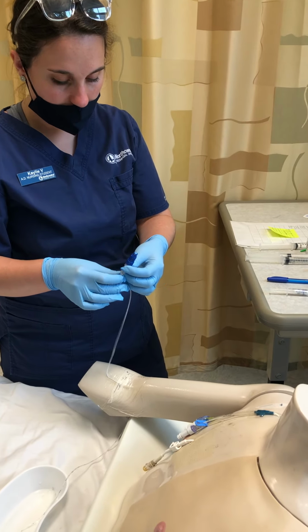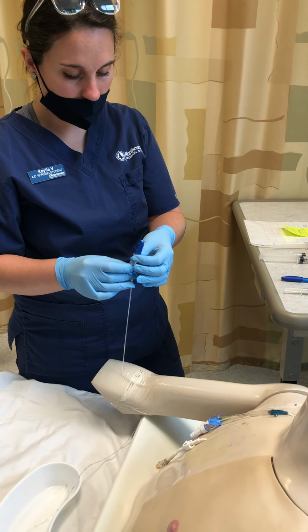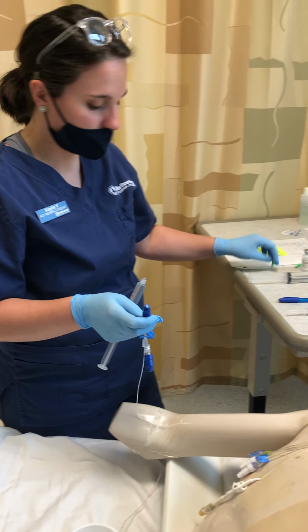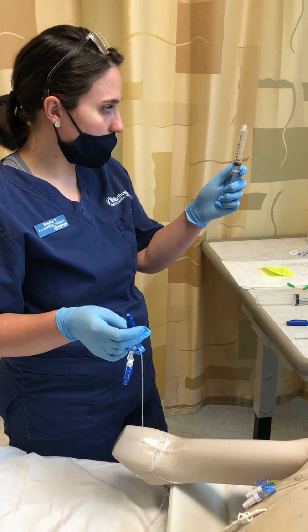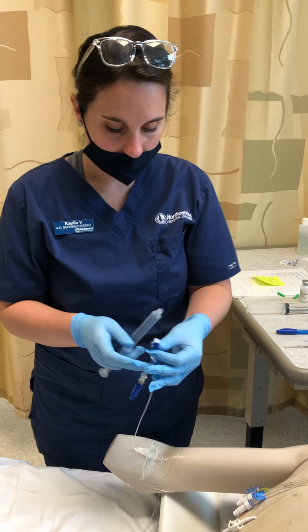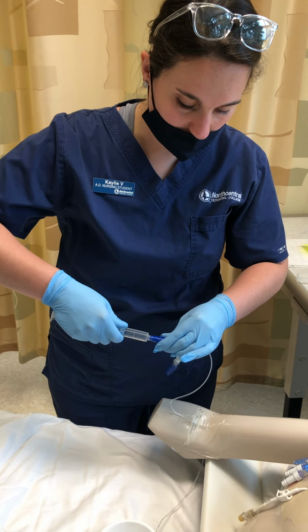I'm going to unclamp it. I'm going to prepare my saline. And I'm going to administer 5 to 10 mLs of normal saline.